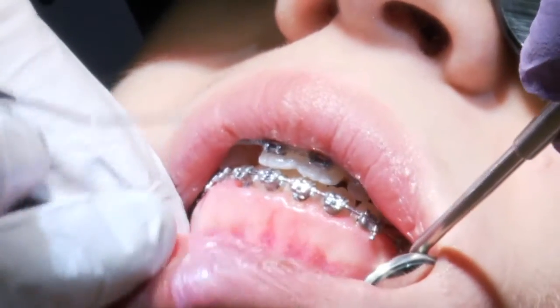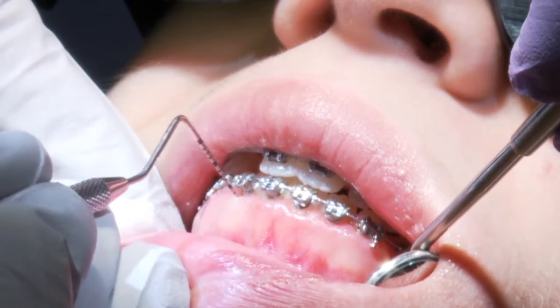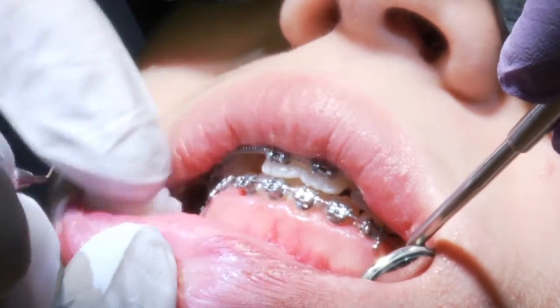This is a 14-year-old girl who has gingival hyperplasia for both medical reasons and orthodontic purposes. The appliance has made it harder to maintain hygiene, so as a result we've had gingival hypertrophy where we see the tissues now up and over, encompassing or engulfing some of the orthodontic brackets.